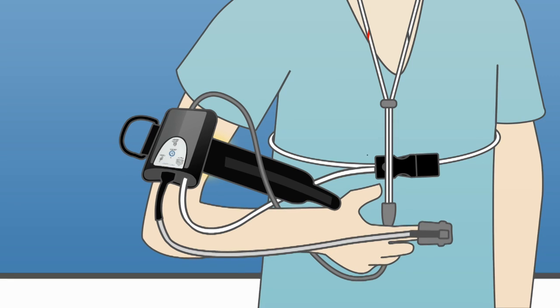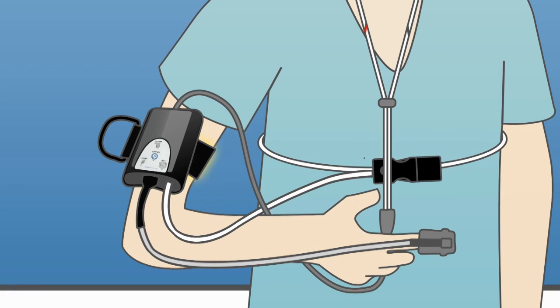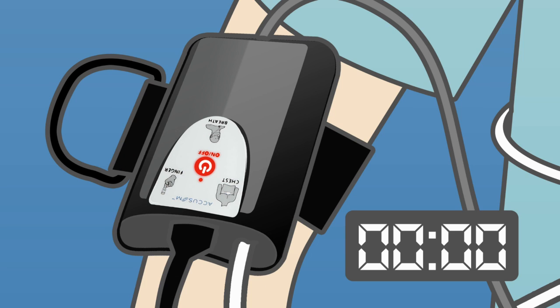The last step is to strap the device to your arm. Then, turn on the device by pressing and holding the on-off button for 5 seconds.